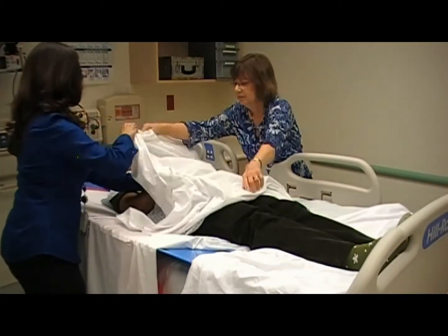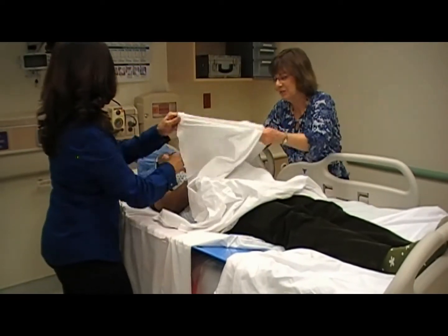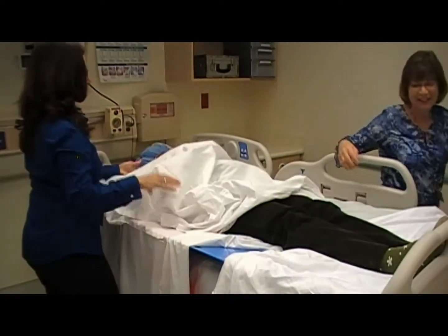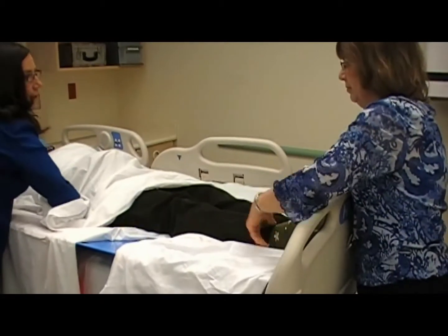For struggling patients, loop longer sheet over the patient to control arms and use a separate draw sheet to wrap around the patient's feet to assist with transfer and prevent kicking.